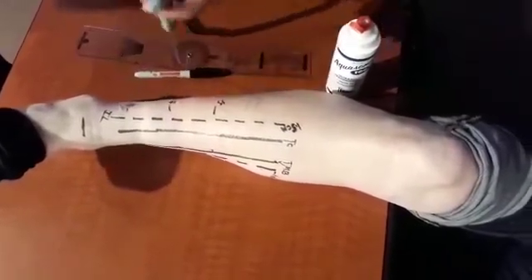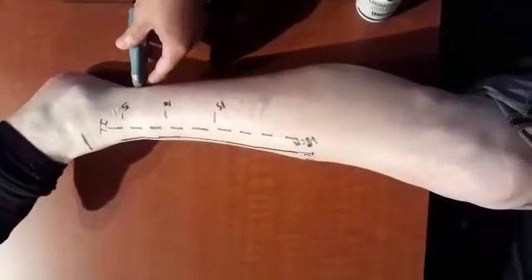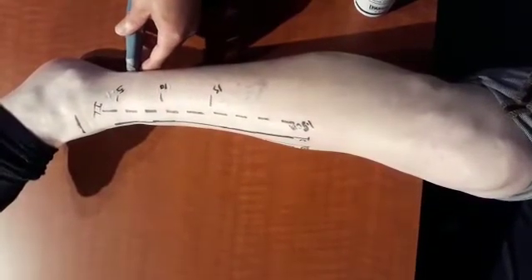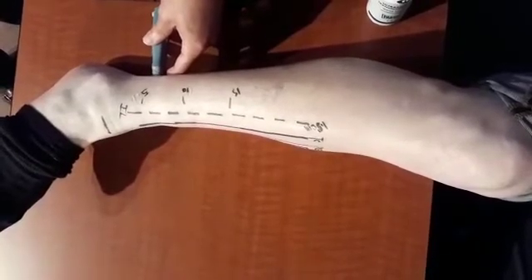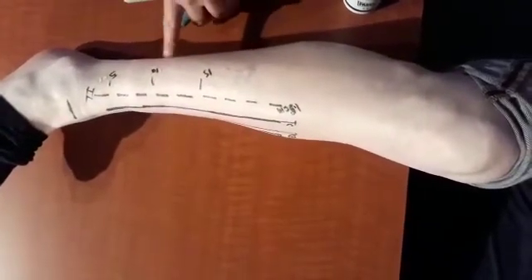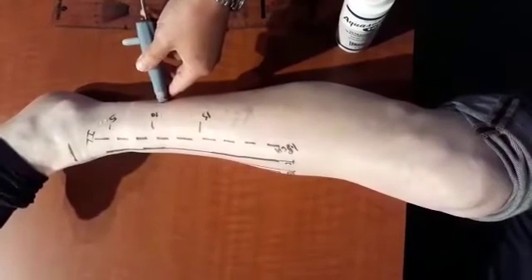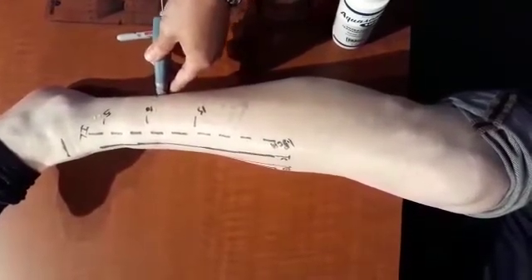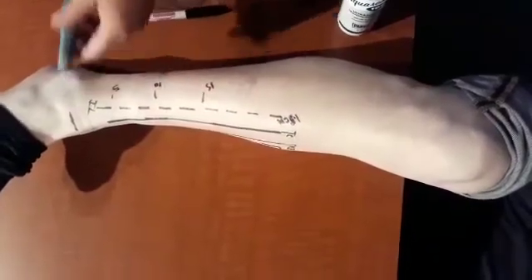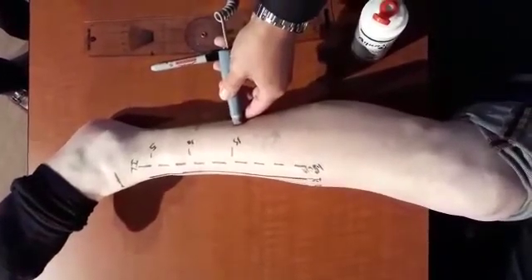Let's go behind the fibula, because we know that behind the fibula you have the septal — a continuation of the septal perforator flaps — at 5. Nothing there. Let's go on the 10. He has a good septal perforator, peroneal pulse. Let's go at 15 — and he has also a good one.